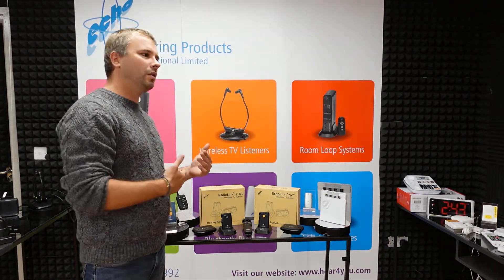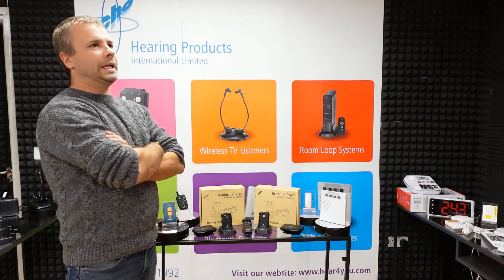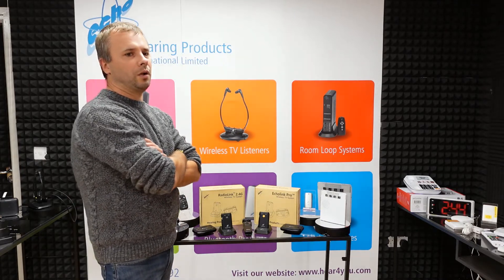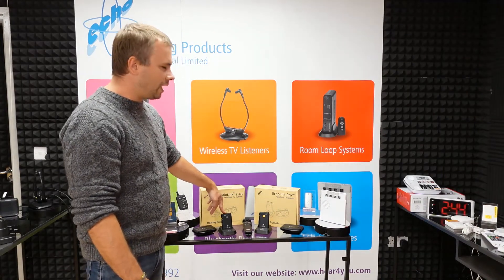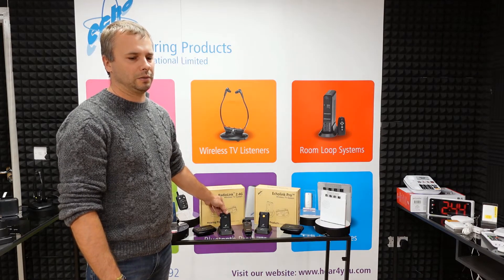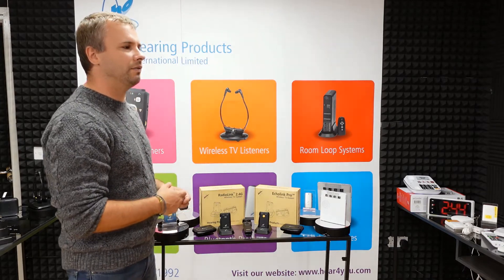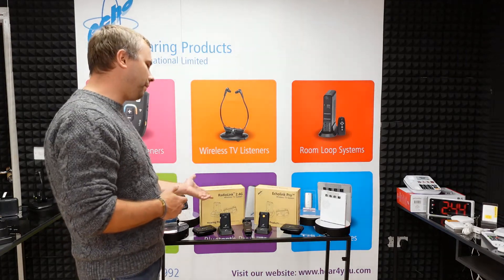When or who should use RadioLink 2.4G and who should use Echolink Pro? Echolink Pro, because it uses infrared, can be a good choice when you have a lot of 2.4 gigahertz devices around your home — for example, routers or cordless phones — since it operates on a completely different frequency. With RadioLink it's very unlikely to interfere, but it could happen with other 2.4 gigahertz devices, even with the frequency hopping technology that selects an available channel. So if interference is a concern, Echolink Pro is the better choice.